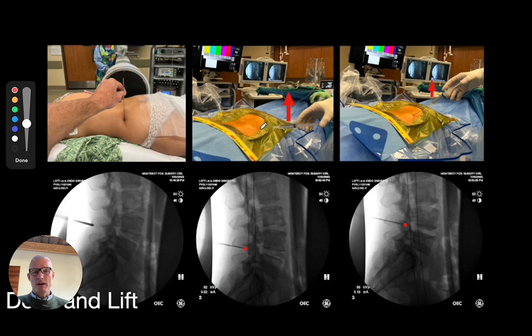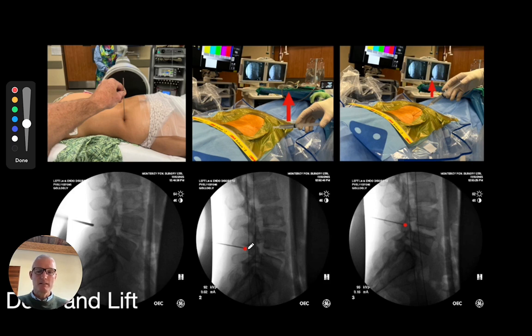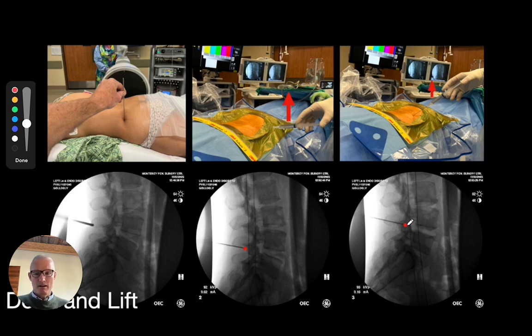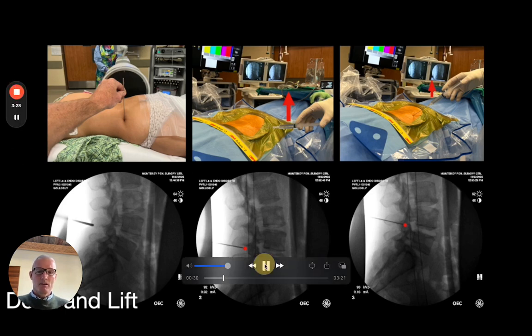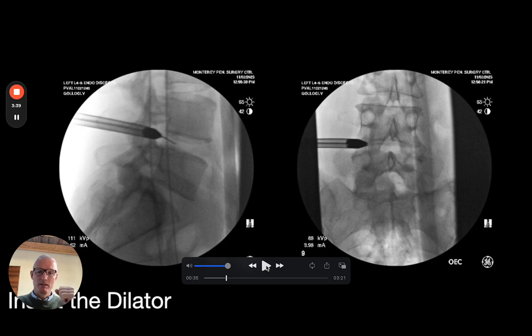I compress the skin slightly with the use of the switching stick and then verify my starting point. I then introduce a spinal needle at a shallower angle than I would anticipate based upon my preoperative templating and dock that needle on the facet complex. After feeling the positive stop of the needle on the facet complex, I back my hand up to clear the fascia, lift it, and advance again, now docking further ventrally on the facet complex. Then I back the needle up one final time and feel the needle skive off of the ventral surface of the facet and pop into the foramen. Once the nitinol wire goes into the foramen, the dilator is then inserted, and what I like to feel here is the resistance of the dilator on the ventral surface of the facet complex.